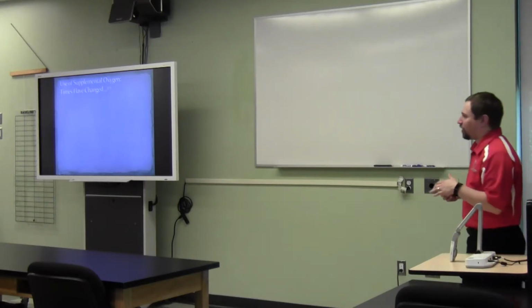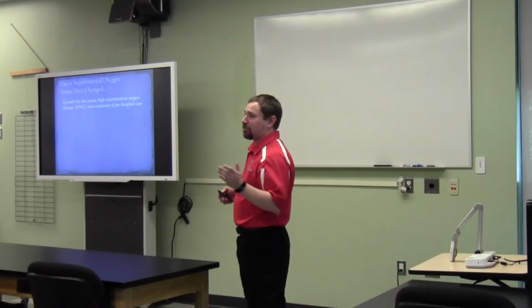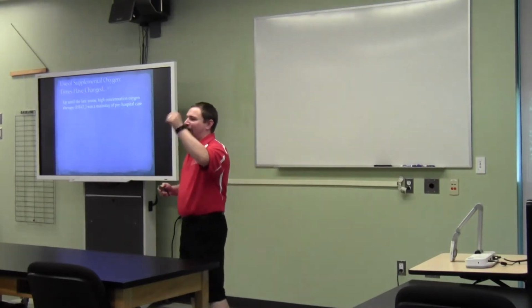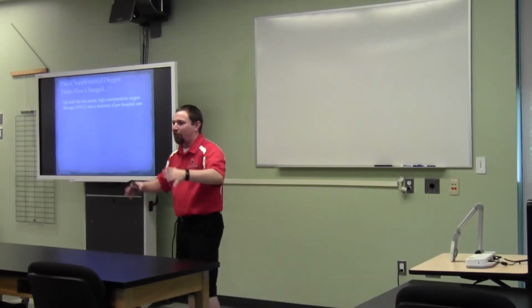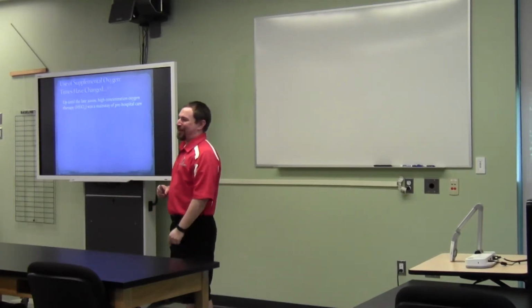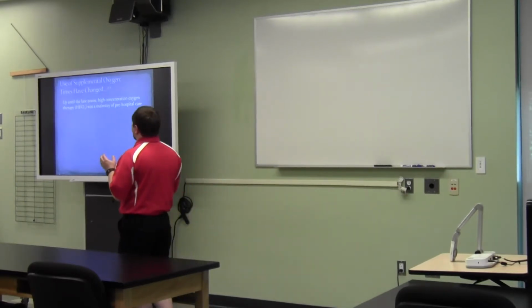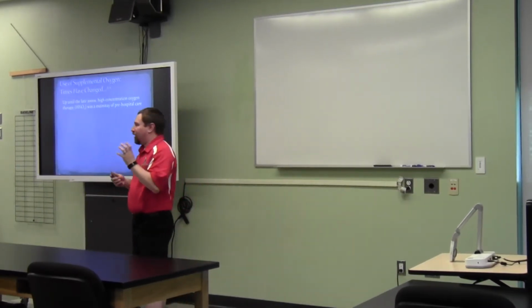Yep. All right, so now we're into the oxygen component of this presentation, okay? So, times have changed, okay? Back when I went through EMT school, the answer was high flow oxygen, high flow oxygen, high flow oxygen. Oxygen can't hurt you, it can only help. Well, then we did some research about that and went, whoops. But high flow was our answer to everything, and it's not anymore.